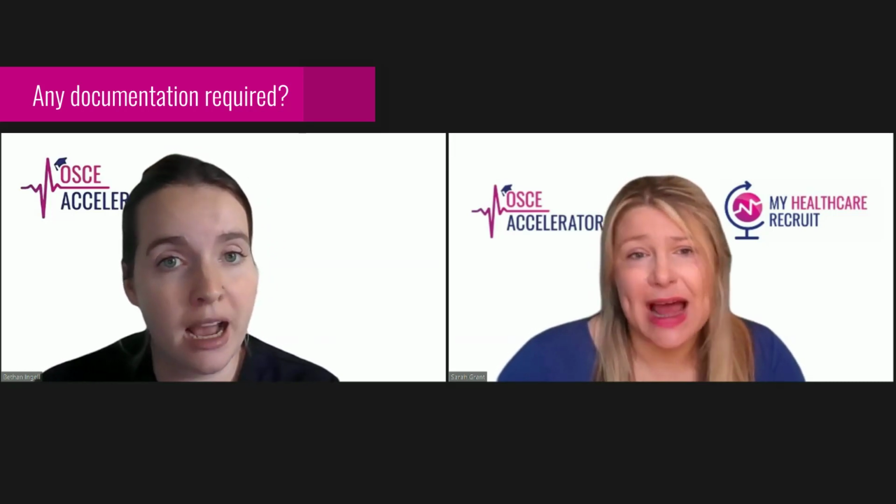And is it always the highest of the 3 readings that you take? Yes, the highest of the 3 readings. That's to measure their best reading. Okay. So the higher the reading is, the better. Okay. Also, you're going to have a graph there. That's to interpret your results.